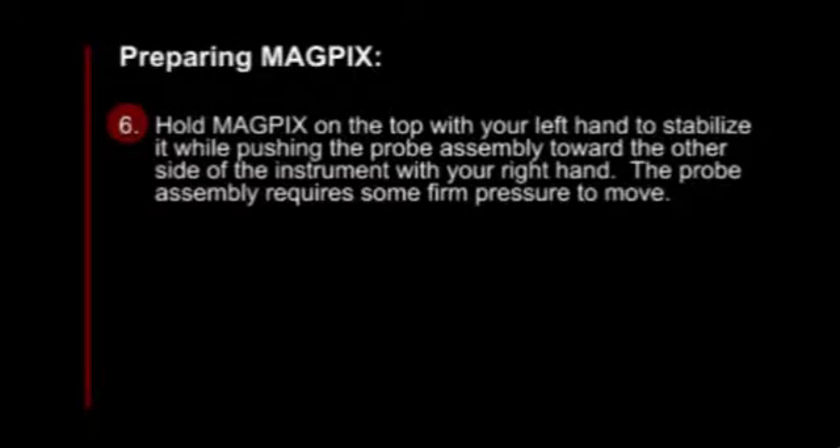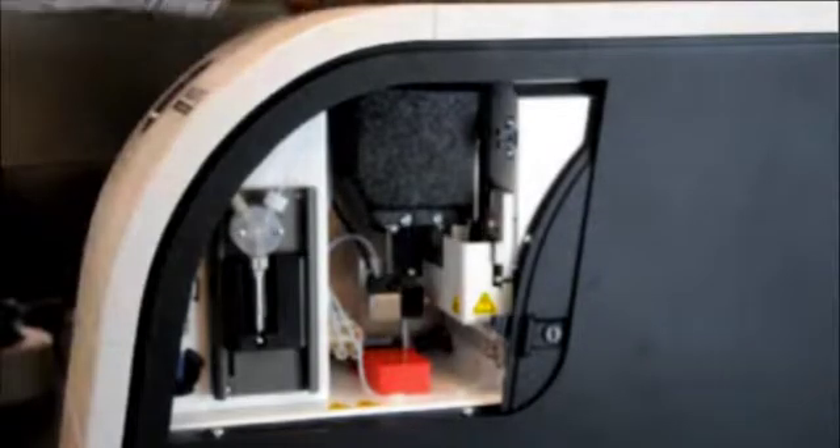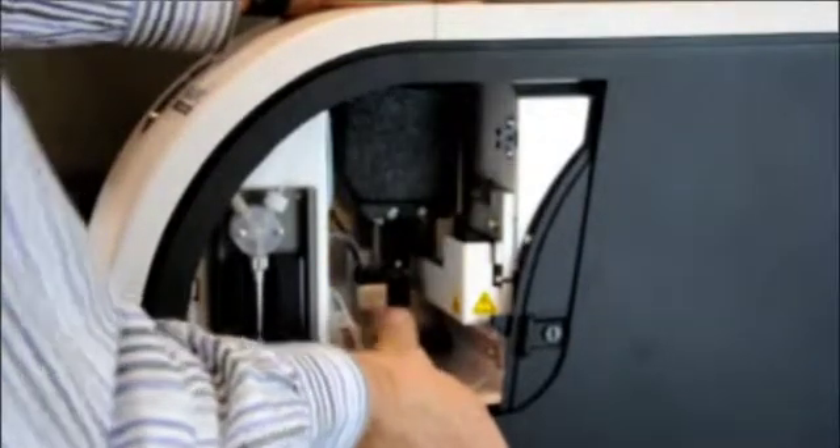Next, hold MagPix on the top with your left hand to stabilize it, while pushing the probe assembly toward the other side of the instrument with your right hand. The probe assembly requires some firm pressure to move. Now, with the probe assembly out of the way, lift out the shipping plug.